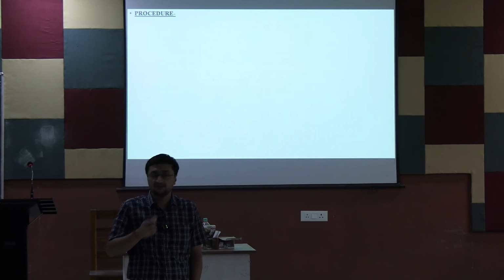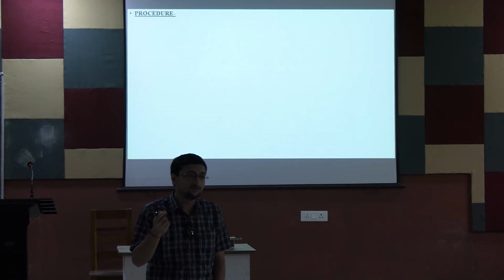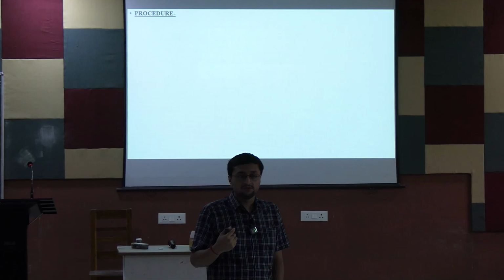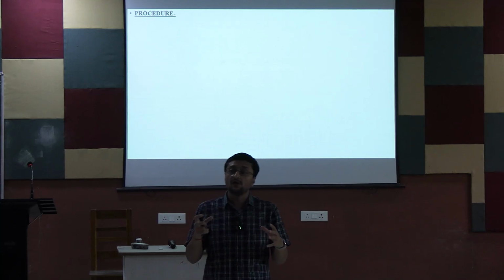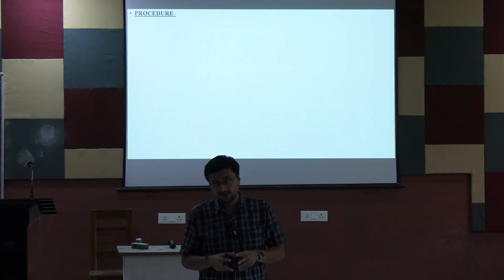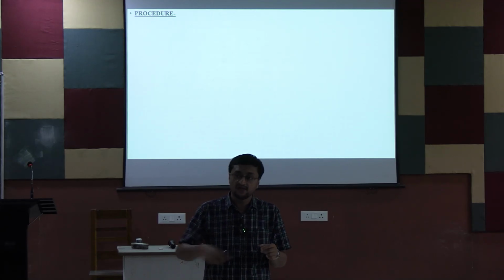As I have already mentioned, the radial artery is the most ideal one from where you can collect the ABG. Why? Because there is a collateral circulation. So before doing the procedure you have to check whether the collateral circulation with the ulnar artery is patent or not, right?